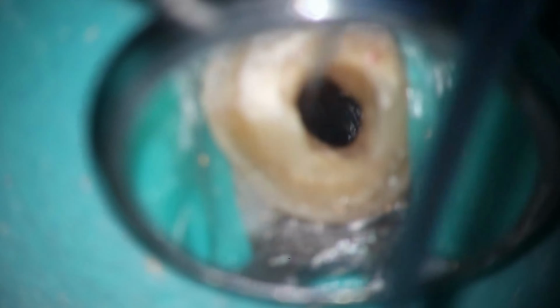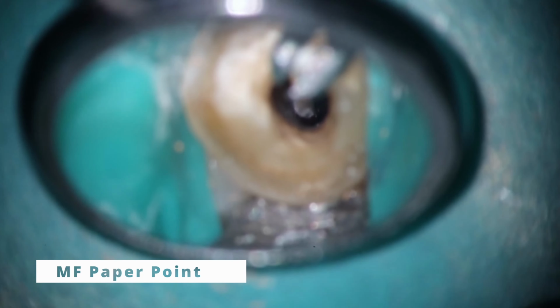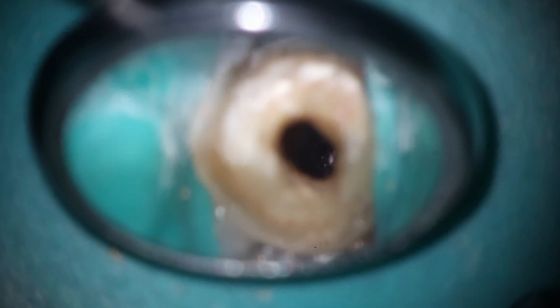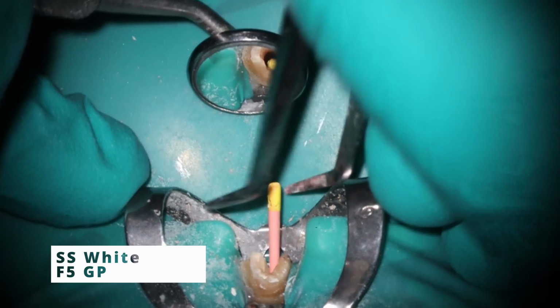It is only 18 millimeters long, so it's not like it's a crazy, crazy long tooth here, but that's what we're seeing. That little bit of bleeding is pretty much normal. I'm not concerned about that at all. I'm gonna use the paper points here just to get it extra dry. A few paper points here just to ensure that everything looks great. And then I am going to be using warm vertical for this technique. So this is the sized F5 cone from SS White.